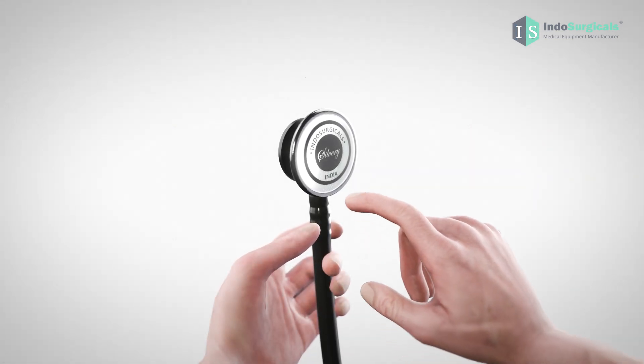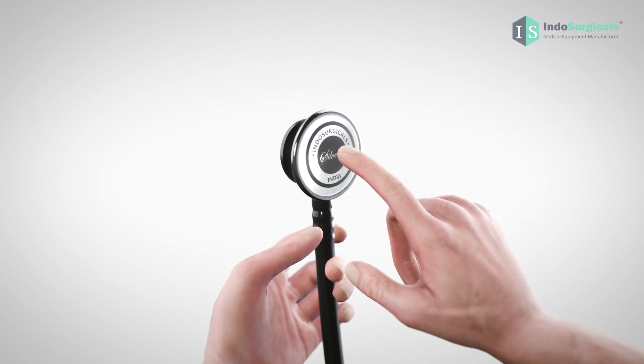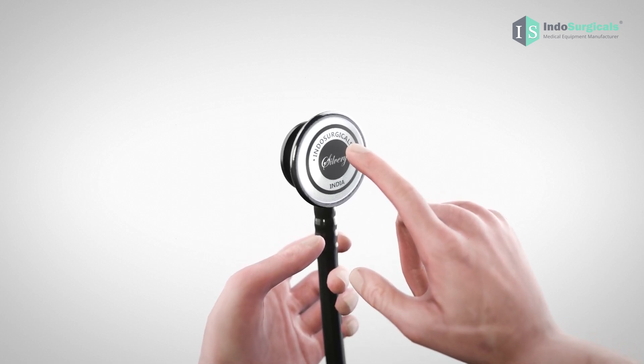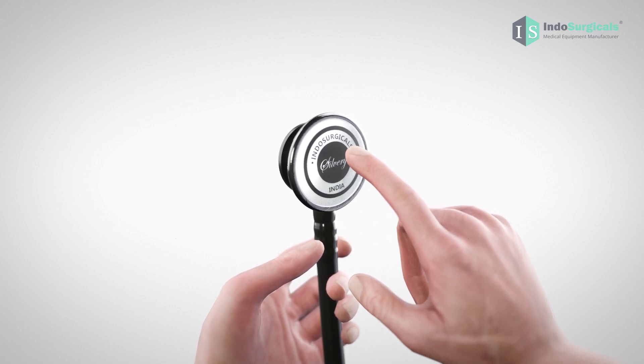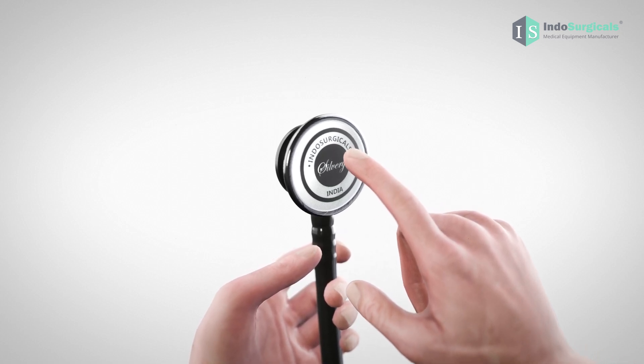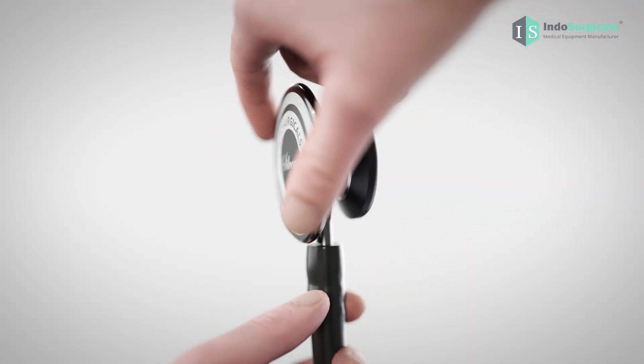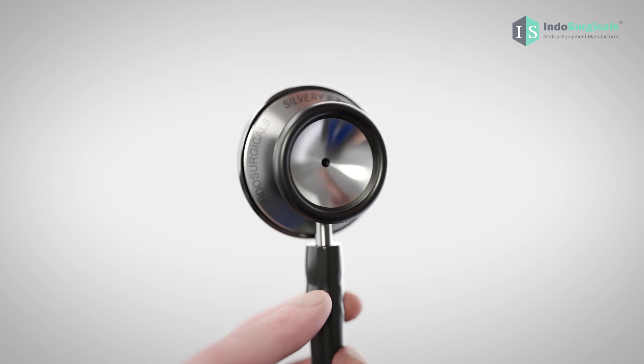You can also do a quick check by tapping on the diaphragm. If you hear a crisp and clear sound, it means the diaphragm side is active. If you don't hear any sound, it means the bell side is active. To switch to the diaphragm side or bell side, simply rotate the chest piece accordingly.